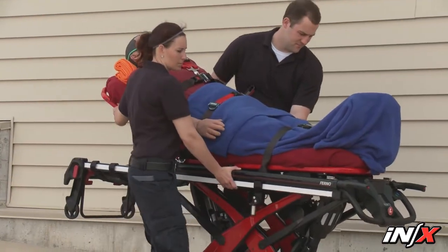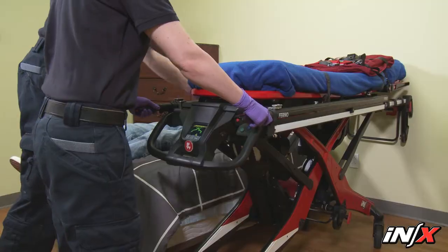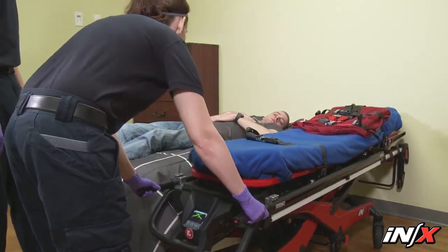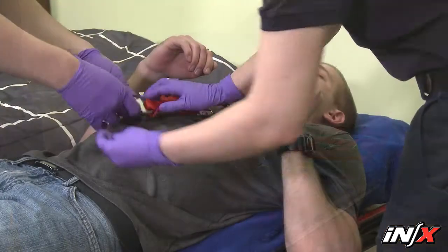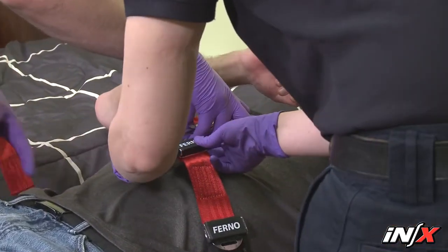Operators must work together and maintain control of the NX at all times. Communicate with each other and use coordinated movements to operate the NX. Stay with the patient at all times and always use restraints to secure the patient.